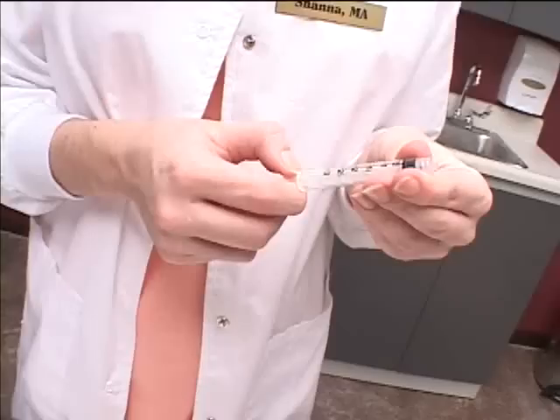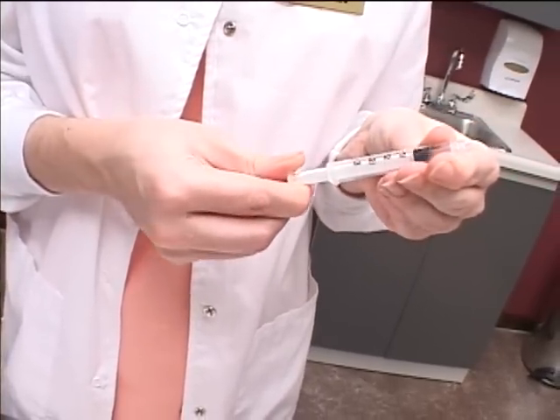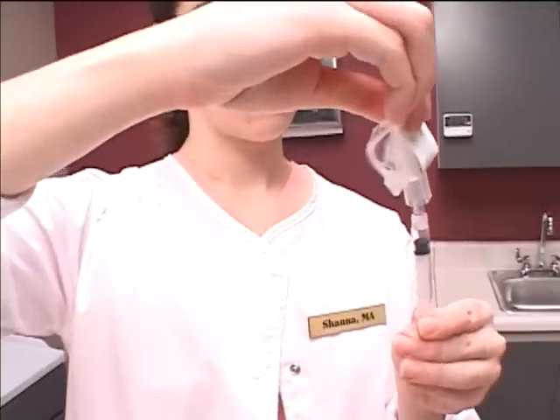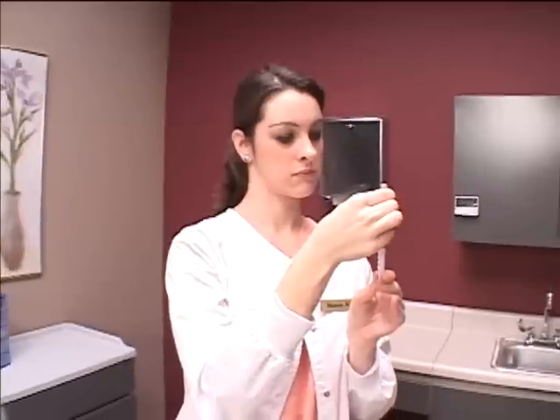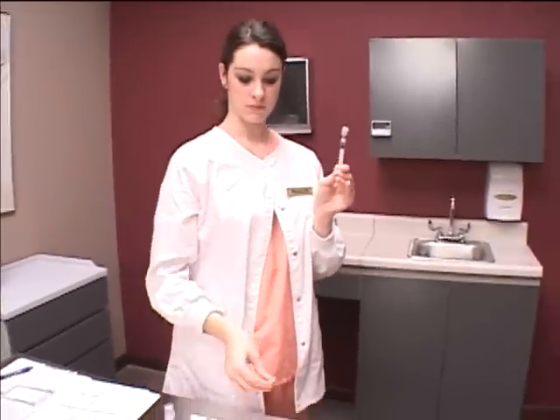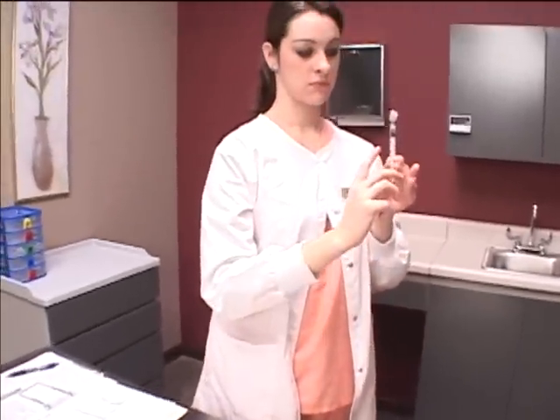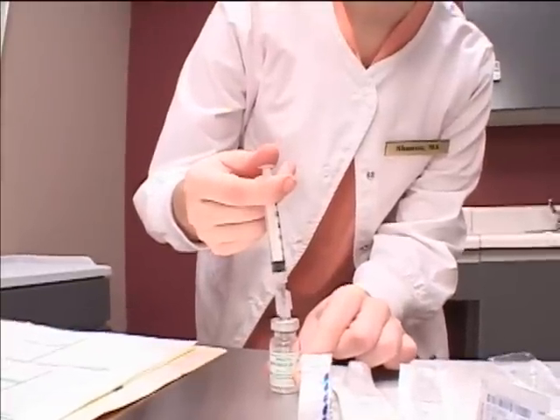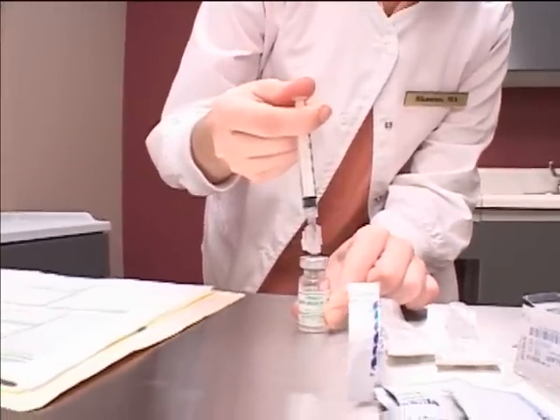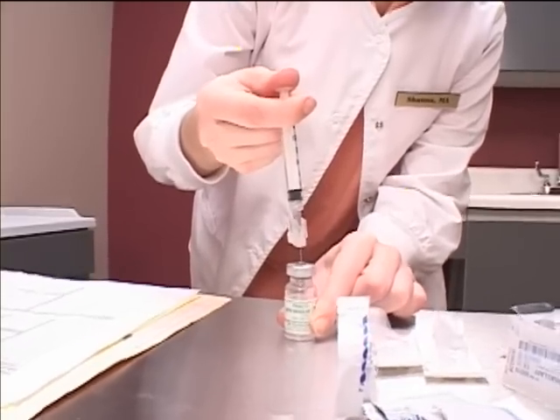Open the syringe and loosen the barrel. Draw air into the syringe equal to the amount of medication to be drawn up from the second vial. Unwrap the needle and place the needle on the syringe. Remove the cap from the needle, being very careful not to stick yourself or contaminate the needle. Place the cap on a clean surface. Inject the air into the second vial and remove the syringe and needle from the vial. Make sure the needle does not touch the liquid.